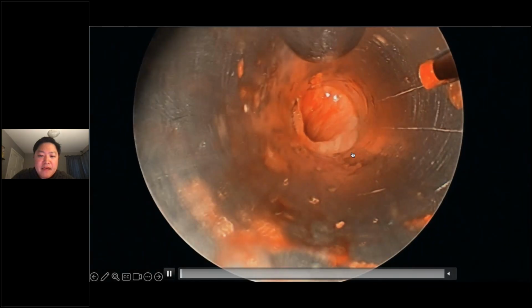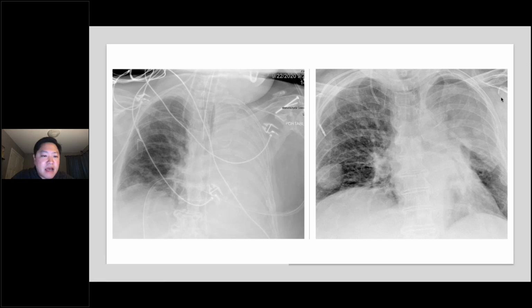Okay. And then the patient did well after that debulking and stenting procedure. You can see before the intervention, which is on the ventilator, obviously, and then on the right, there's a left main Aero stent. You can see the left lower lobe opened up pretty nicely, the big mass in the lingula and left upper lobe. And the patient was extubated and underwent treatment for advanced stage lung cancer.